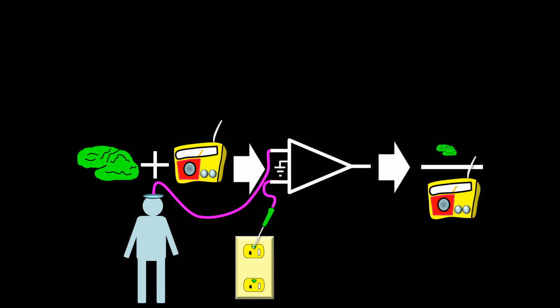The result was an epoch full of noise. So connecting input 2 of an amplifier to the ground was a bad idea for two reasons. One, a noise-filled EEG, and secondly, as you can imagine, danger of electrocution.